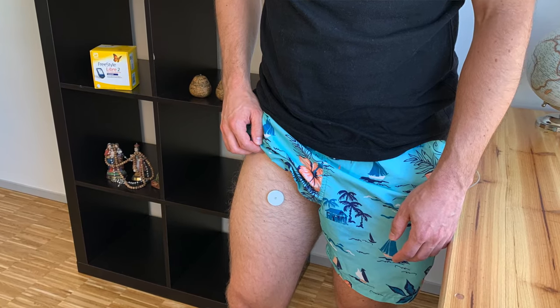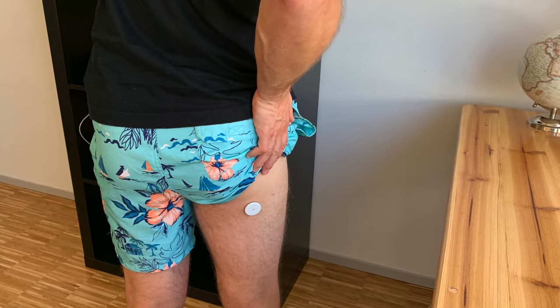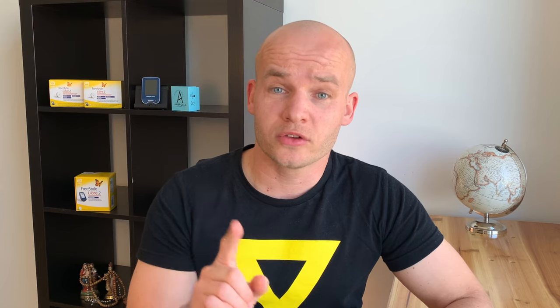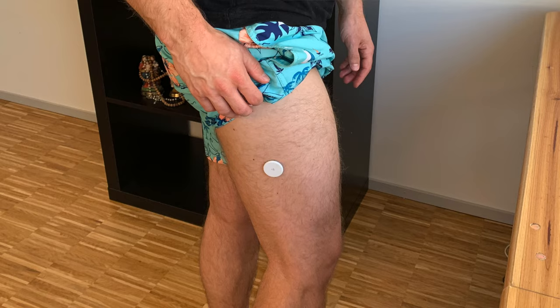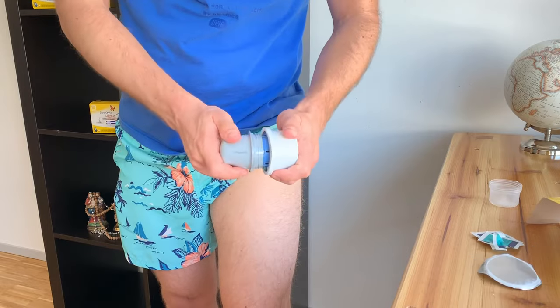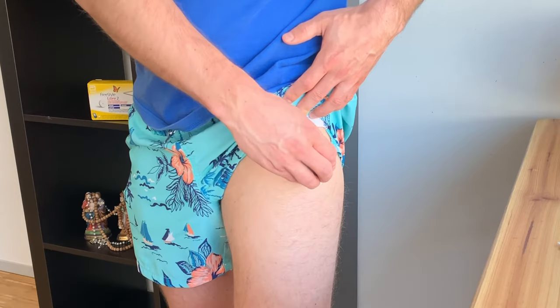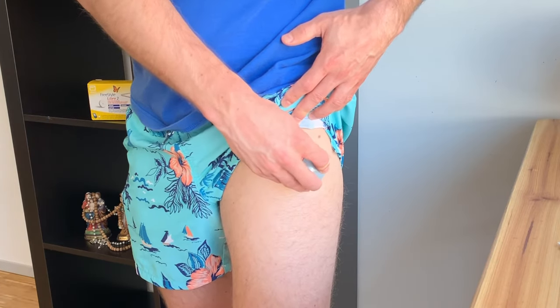Another option I heard about but haven't tried is putting the sensor on the back side of your thigh right under your butt. One thing to note: please do not put the sensor directly in a muscle — this could be very painful. Also avoid spots where you typically apply insulin, because putting the sensor too close to your insulin site could have a negative impact on accuracy. It is actually super easy to apply the sensor in your thigh — the leg is easily reachable and placement is much less complicated than putting the sensor in your back arm.